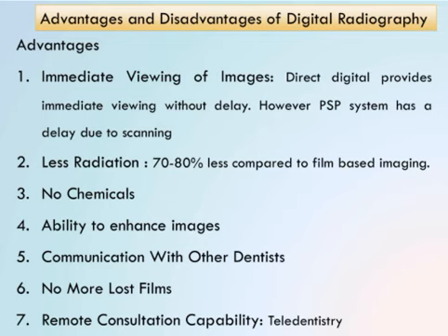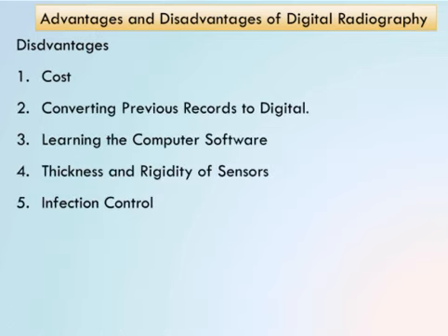Tele-dentistry means you are sitting at the other end and I am sitting in the university now, and we are able to communicate with each other. So this is called tele-dentistry. It doesn't matter where you are and where I am. You get the consultation done with the help of digital imaging systems. Okay, that is an advantage that we have here in digital imaging.